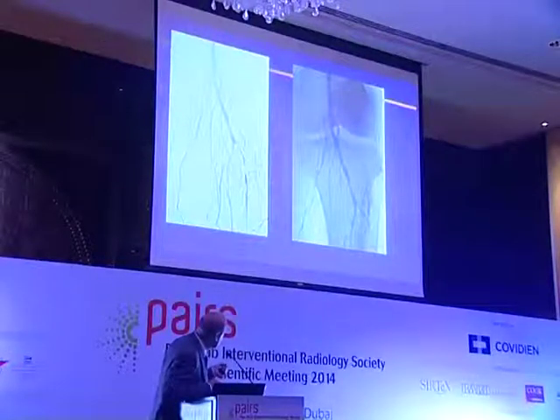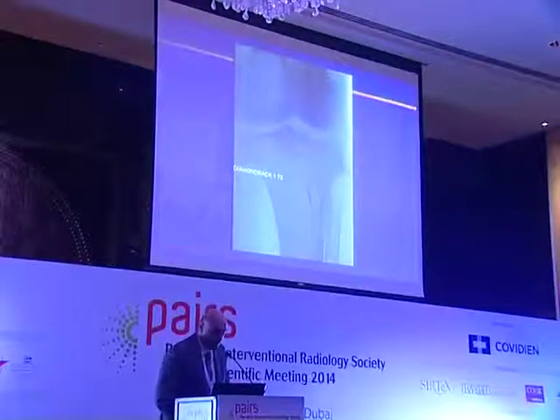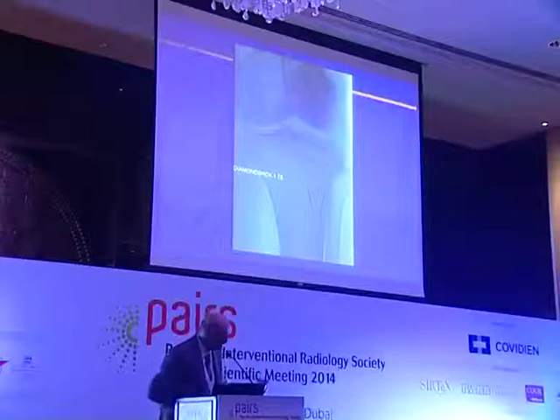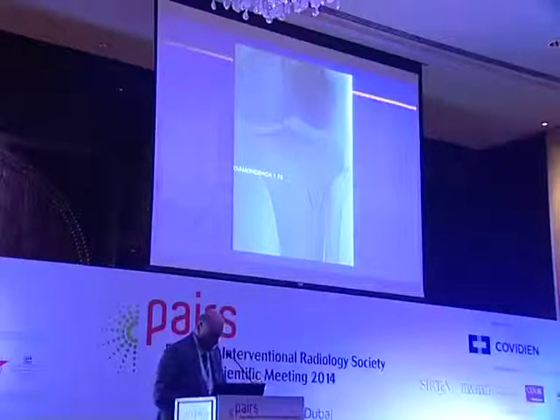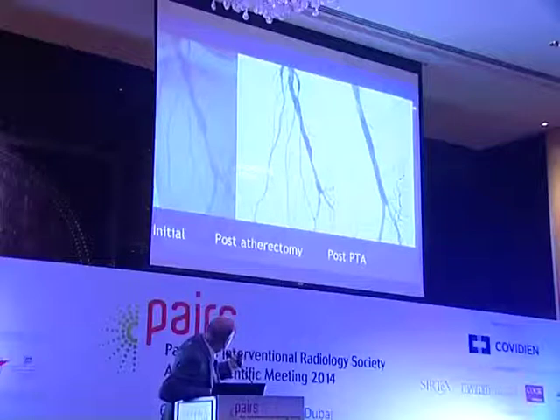different areas of stenosis. There's this area here where you see the calcium, and this is the Diamondback device in action, and this is the active portion of it as it passes and rotates through. They come in different sizes for the popliteal or below the knee. This is after atherectomy, with some improvement.